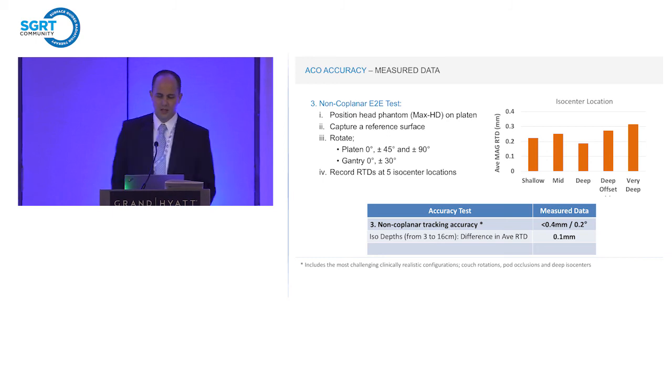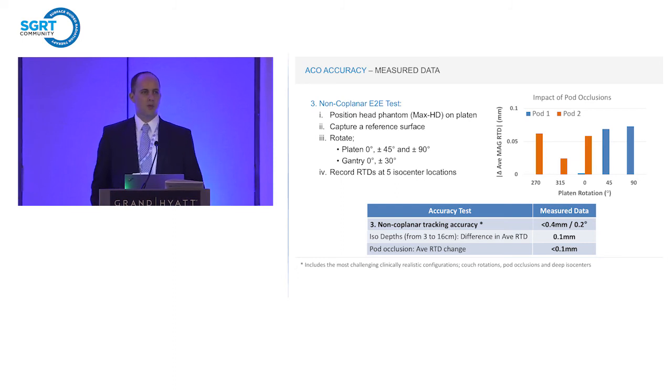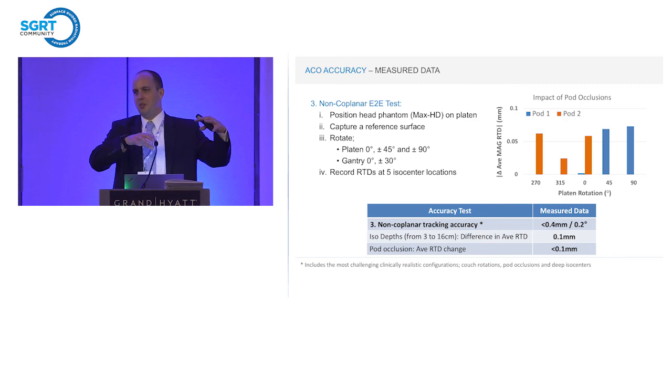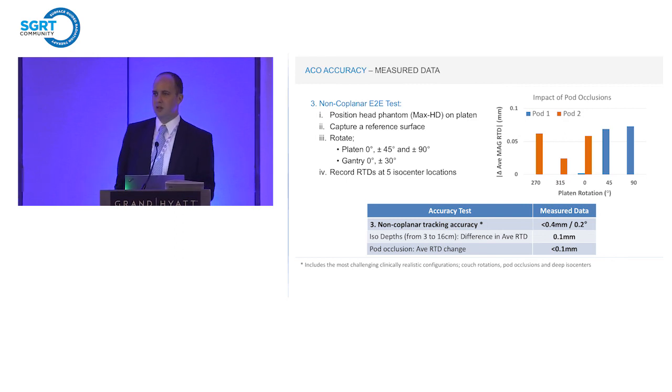So extremely stable. And then similarly, what happens when we block one of the pods? Again, because we have a more accurate calibration model of the different pods, the idea is if we lose information from one, the other two should have enough information and be robust enough to not cause a big difference in the real-time deltas. That's exactly what we saw. We saw less than 1/10 of a millimeter change when we rotated the gantry to block one of the pods using ACO.